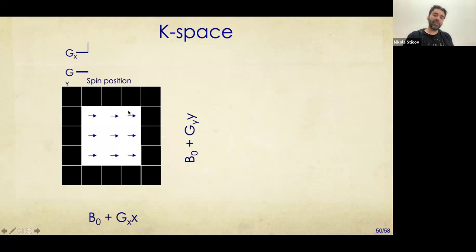So I have just taken all of the spins in that inner square, and I have tipped them into the transverse plane. So this is the equivalent of DC, okay? I have just acquired the average value of all of the magnetization that is present inside the box. But that is not enough to know that inside I actually have a box. Instead, what I need to do is manipulate these magnetization vectors in different ways so that when combined, they will give me different patterns. And from those patterns, I will infer the shape of the object that is inside my black box. So what will I do?